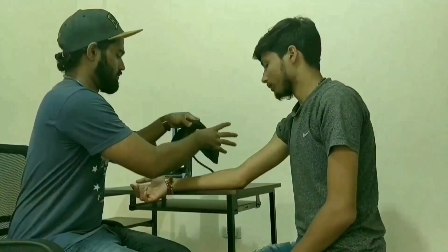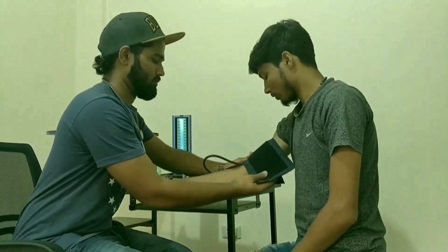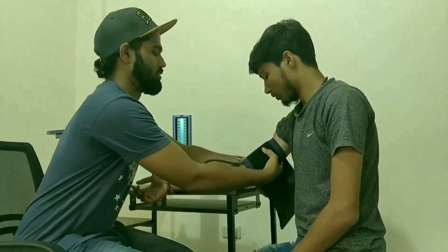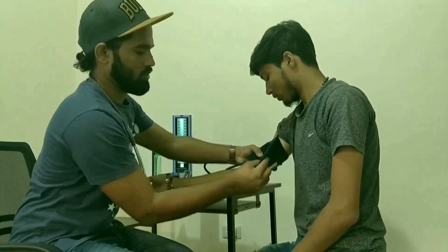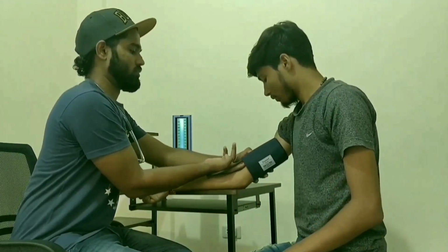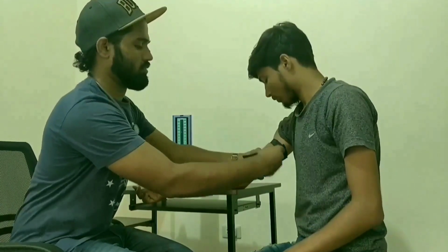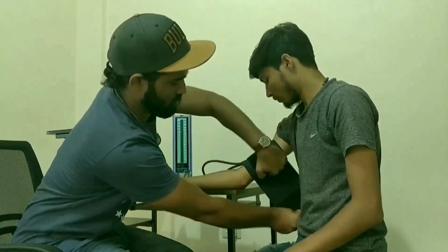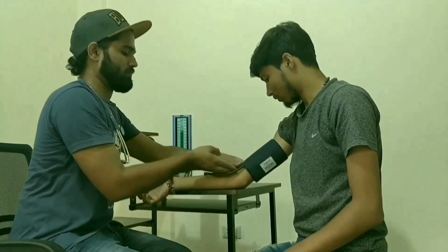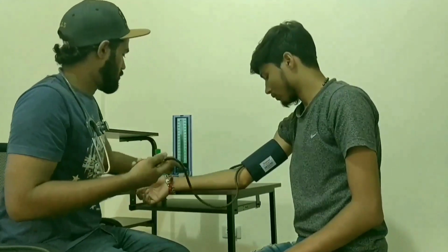No. Okay, so first of all you will tie the cuff on the patient's arm, and you will tie the cuff so that these two pipes fall over the antecubital fossa, and if the cuff is loose or too tight, then you will tie it accordingly. It should not be too tight and it should not be too loose. And check with these two fingers, it should be movable easily.